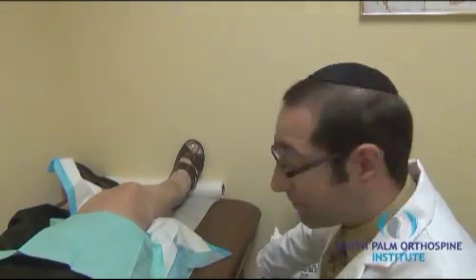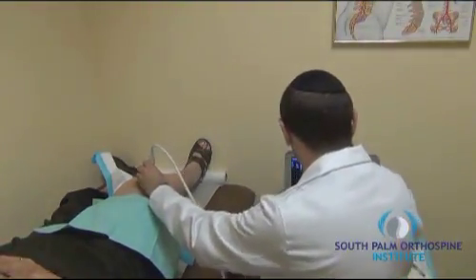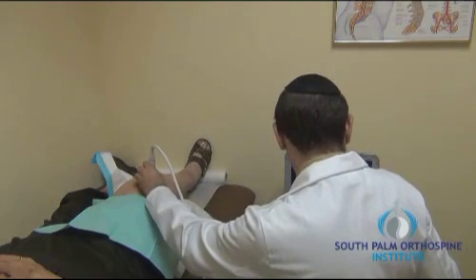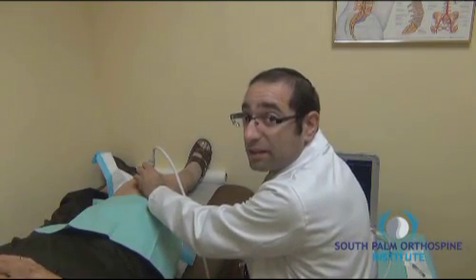The first thing that I do is examine the knee under ultrasound to find the suprapatellar bursa, the area that will be injected.